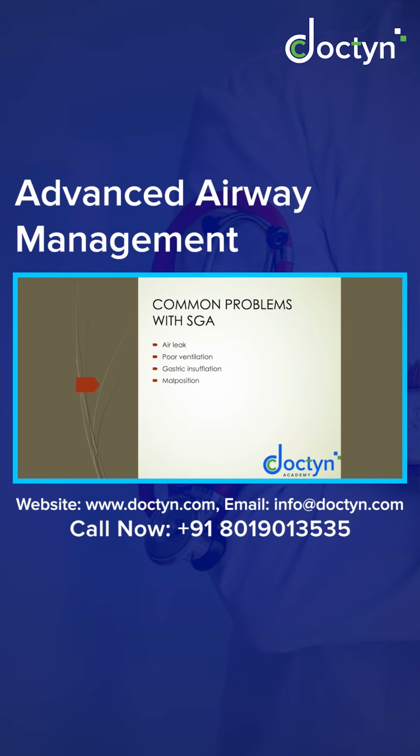of aspiration. And malposition: anytime when you're putting in the LMA and you move the neck or head or the patient, mobilize the patient from one place to another, there is increased risk of malposition, which will again lead to weak or inadequate ventilation, which would lead to desaturation of the patient.